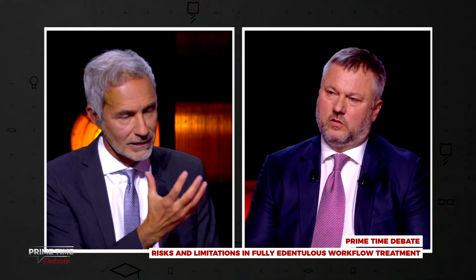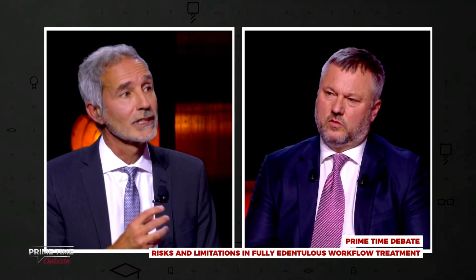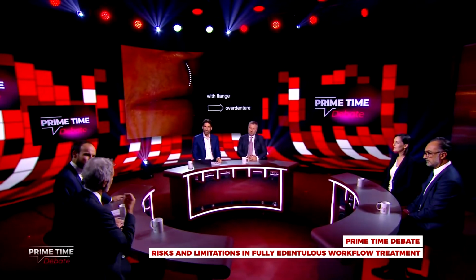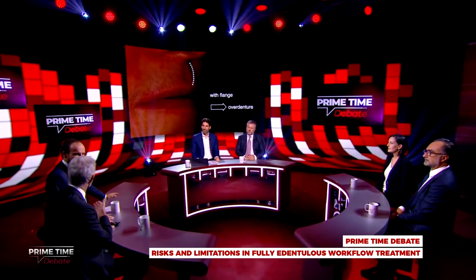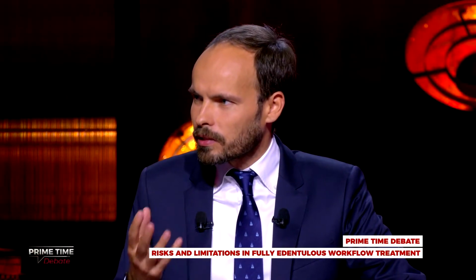The feeling that you have in setting this setup in the patient's mouth is completely different. You can't have the same evaluation and the same reply by using virtual reality or something like this that projects the image. I don't know your opinion, Vincent, but no, there is no chance. You need the actual try-in, you need the actual facial reaction to it, the lip support, you need to evaluate it. There is no chance to visualize that, at least up till today.